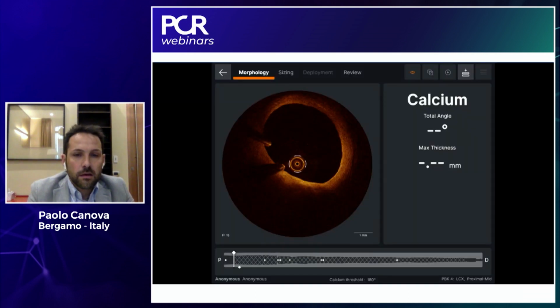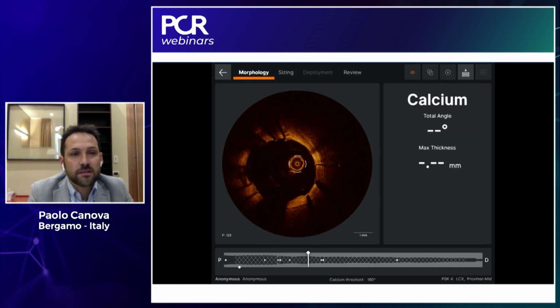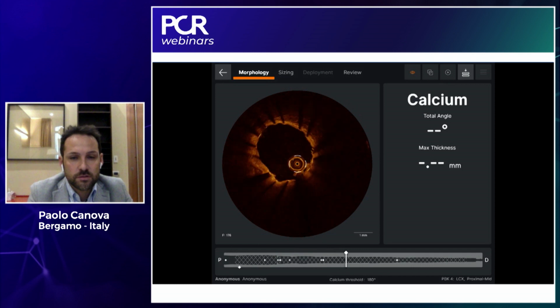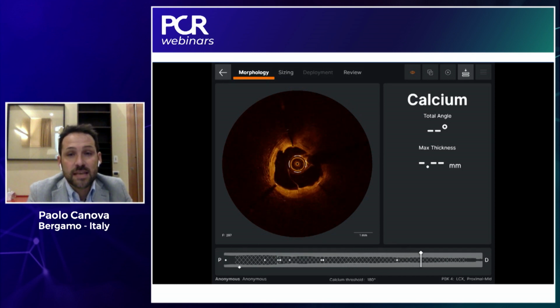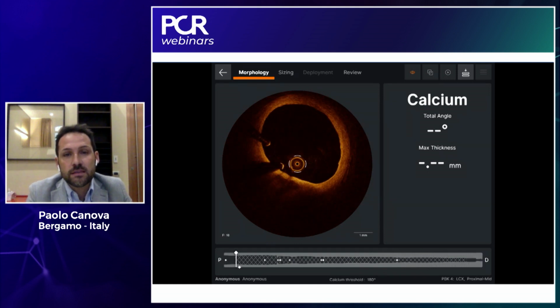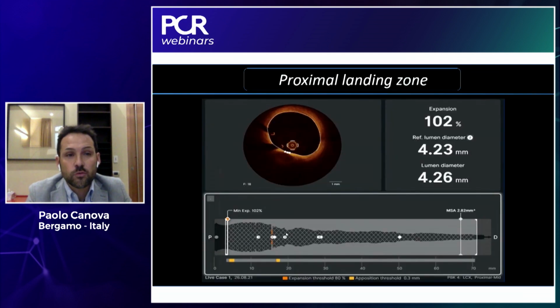Commenting on your OCT pullback after stent implantation, of course, the OCT pullback from the circumflex. As you said, we have this algorithm to follow, and the second part of the algorithm is MAX. M as medial dissection, which means to evaluate where you land with your stent, whether there are any dissections next to the struts of the last part of the stent.